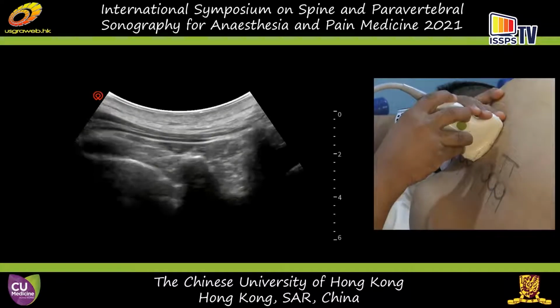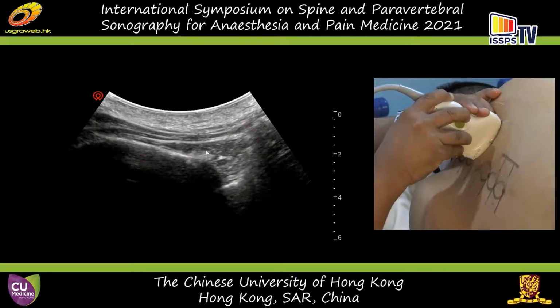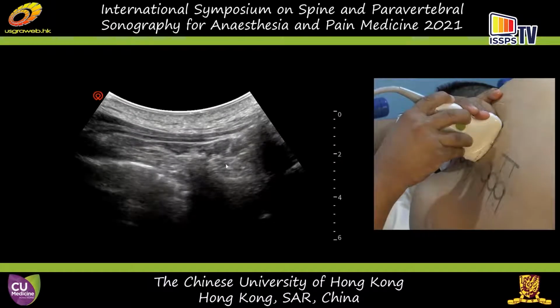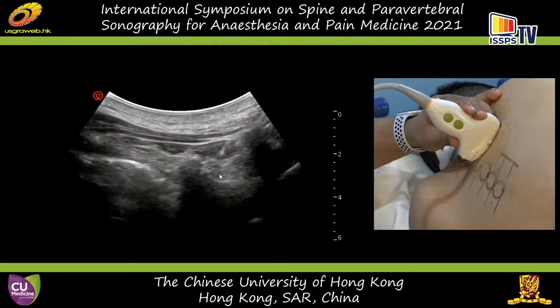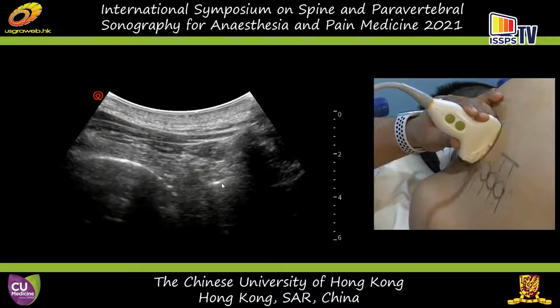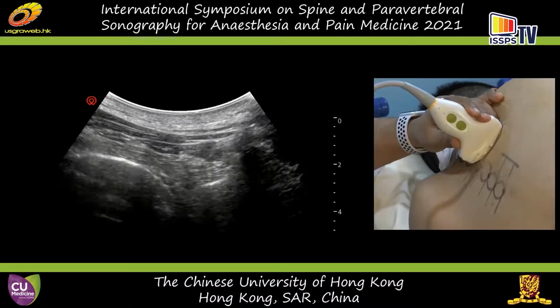Now, I would focus on the third window, okay? Now we come back again. This is the transverse process rib window. This is the transverse process window alone. And now we are going to just go below the transverse process. So now you see the acoustic shadow of the transverse process. Can we reduce the depth? It'll just improve the zoom of it a bit.